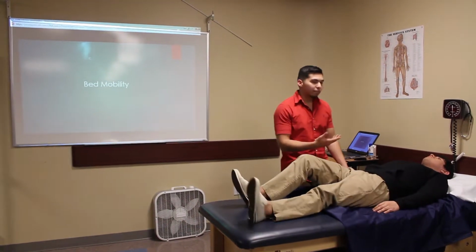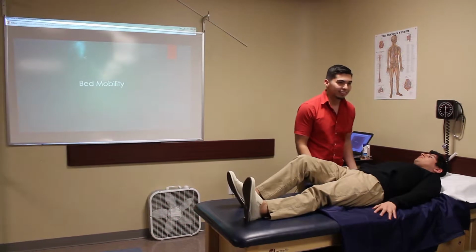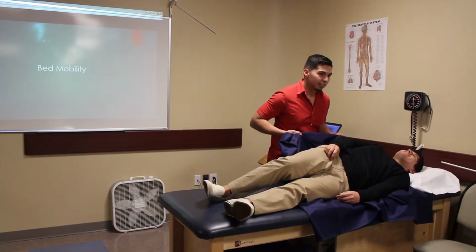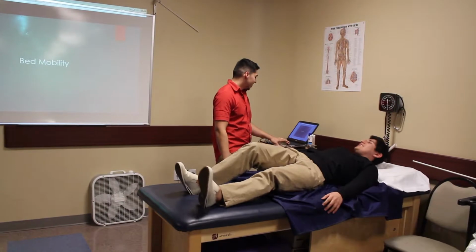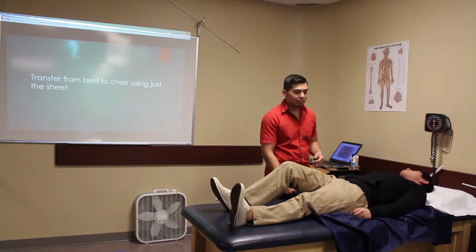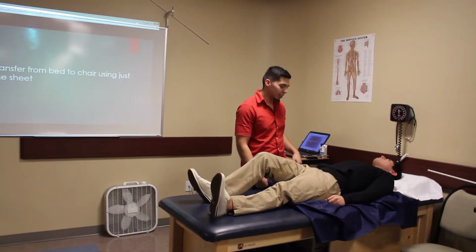Let's say you have to turn the patient to their side and they're not able to. Just be careful, don't fall. It's slippery. You just pull the sheet and they slide to the side. Oh man, that's cool. And the same vice versa. You can come back. The next one is transferring them from the bed to the chair using just the sheet. So we'll head over there and show you guys how to transfer using just the sheet.